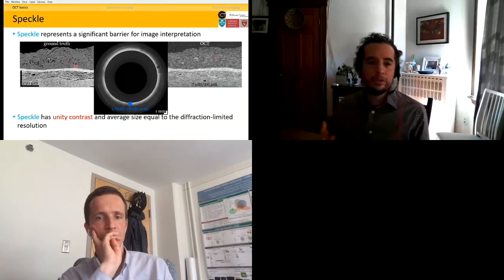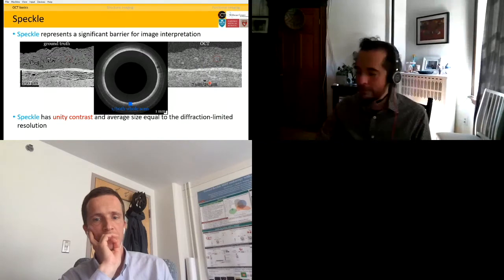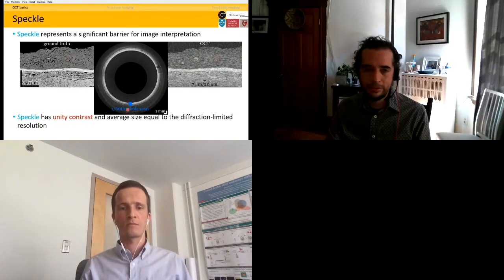And then if we use the known physics of OCT, the B-scan of this ground truth would look like this image that we have on the right. For this one, I chose a typical endoscopic resolution. Actually, the black dot here is the PSF of the system. So what we can see is that there's definitely this pervasive grainy pattern in the image. This is speckle. And I want to clarify that this is just 1/60th of this whole scan.